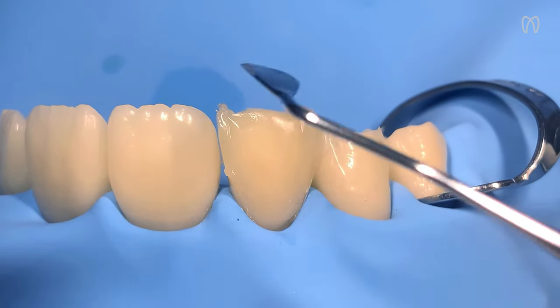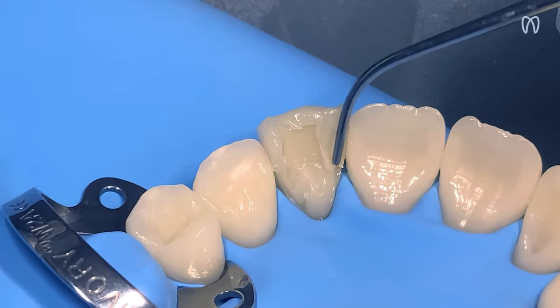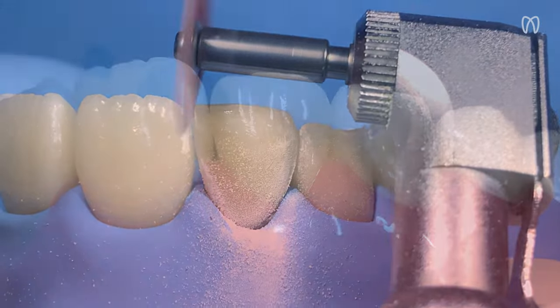With the help of Unica Mini Deep Anterior, we achieved a functional, anatomical, and aesthetic restoration in just one session. A truly time and cost-effective solution.